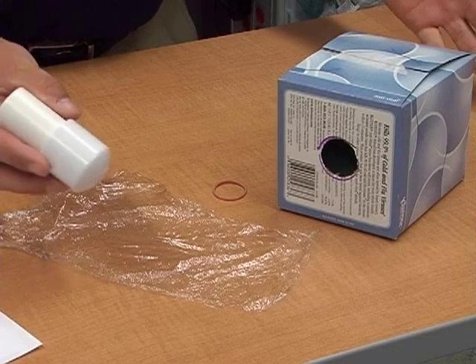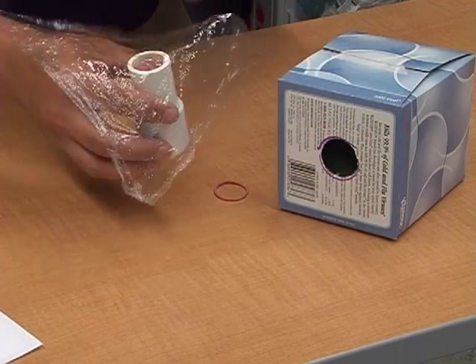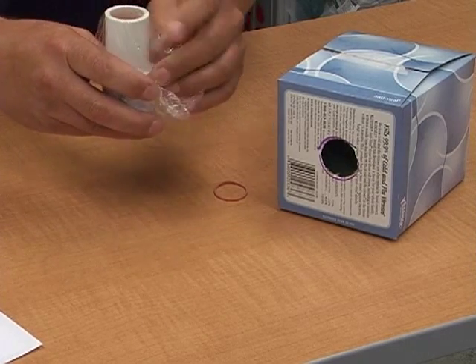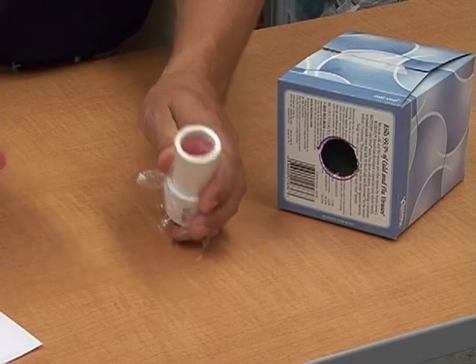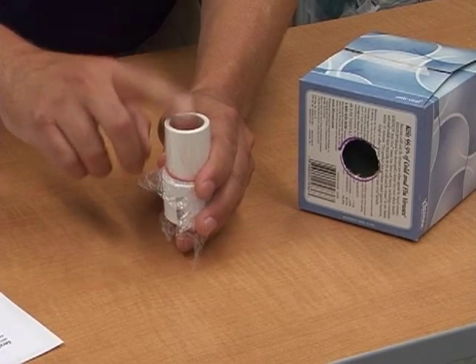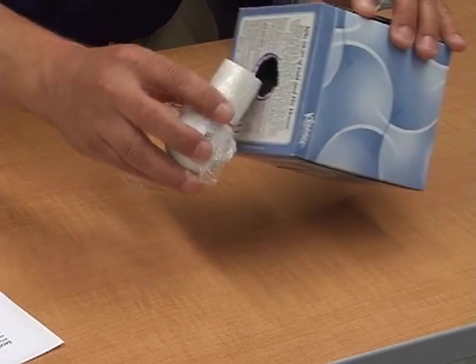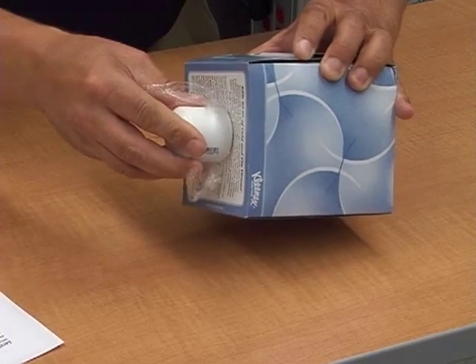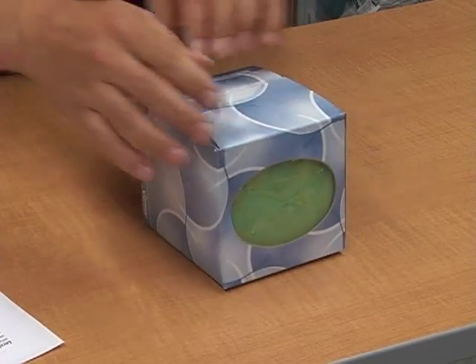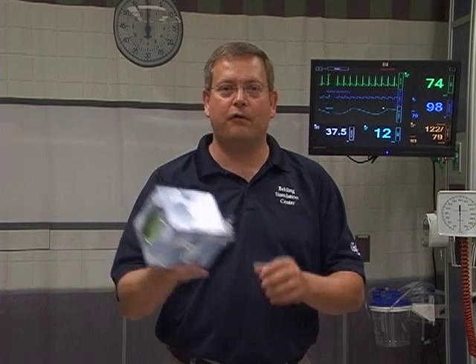Now that our gel has all cooled, our cervical model is ready to go. Take your piece of saran wrap — bigger is actually better so you can move it around and use it multiple times. Pull the saran wrap tight on the cervical model, hold it in place, put your rubber band down, and roll it down as far as you can. This tension is going to create a nice tactile feel for your learners as they pass through the cervix. Slide the model into your pre-cut hole, push it in, and you're officially ready to do either an endometrial biopsy or a DNC.